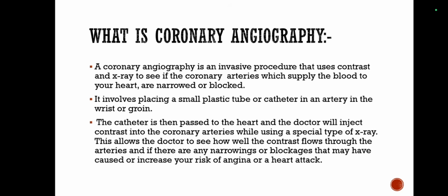It is minimally invasive, and they use contrast and X-rays to see whether the coronary arteries that are supplying blood to our heart muscles are blocked with any kind of plaque or fatty deposits. So this coronary angiography is a procedure that helps us to find if there is any block in the blood vessels of the heart.